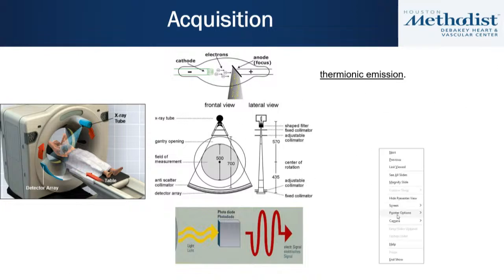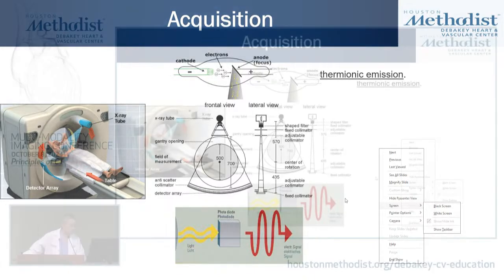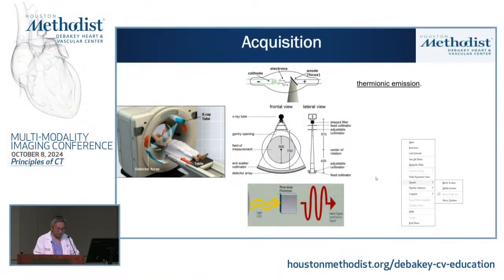And depending on how much energy we apply, that is completely controllable by you. You can determine what the maximum energy you want, okay? So remember this part. This is the part where we acquire the images.